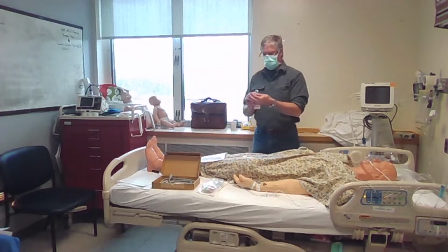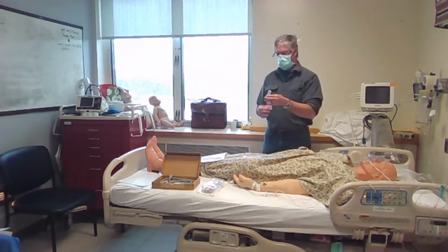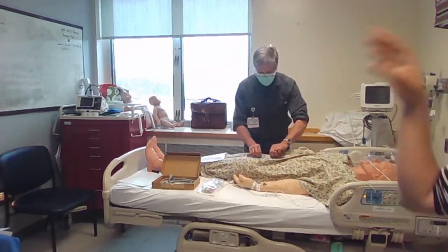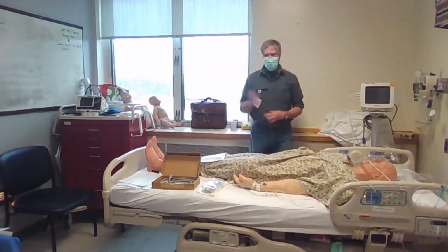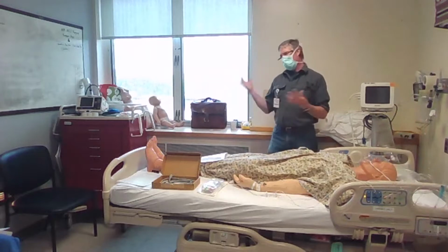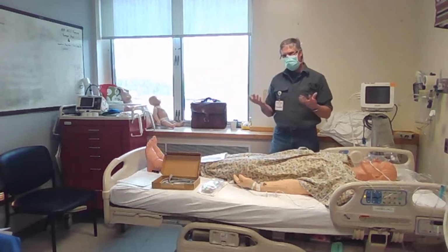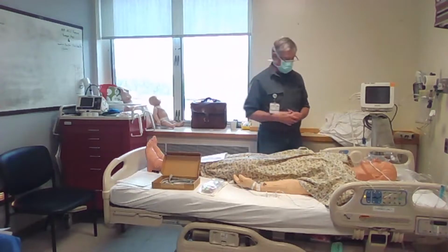So it doesn't have a valve in it or anything. No, there's no valve in it. Make a mess. But, and you guys can look at this. If nobody's holding it, you're gonna have some nice pretty paintings on the wall. Yeah, and it'll spurt out, but it doesn't really shoot way past the hand or anything for the most part. A lot of times it'll just kind of shoot into the palm. It's not gonna like shoot across the room.